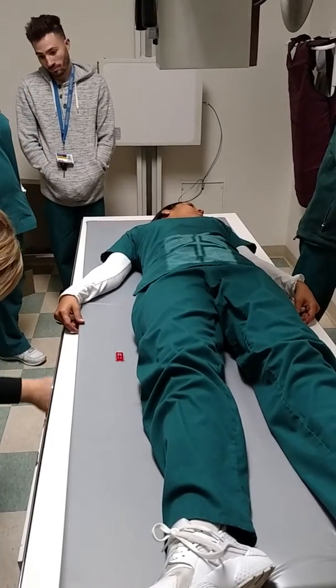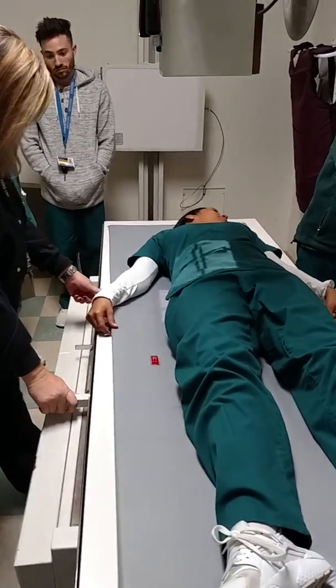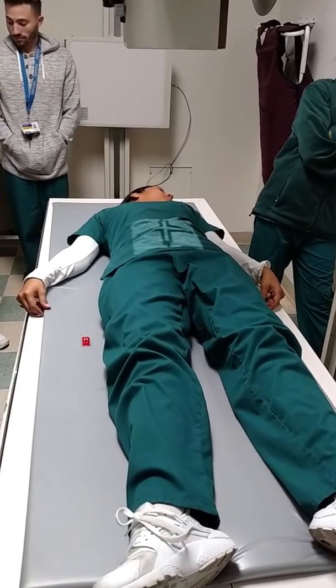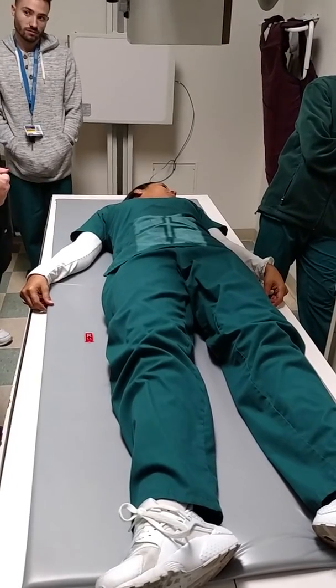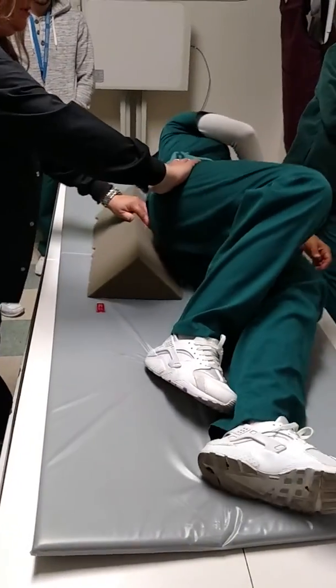All right, let's say we want to see her right posterior brim. What position should we put her in? I want to see her right posterior. If you want to get it in someone's posterior, what do you got to do? Put it up. So we're going to put her posterior up, lay back.